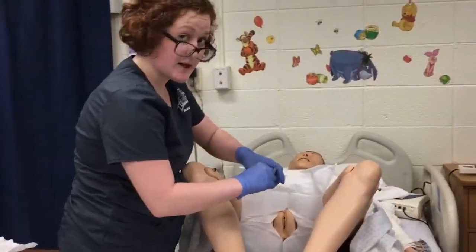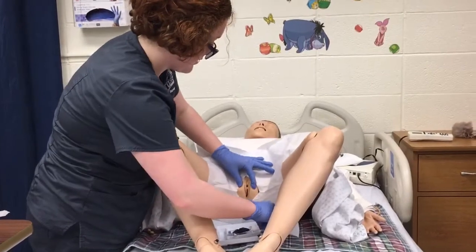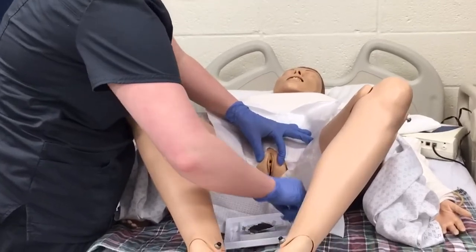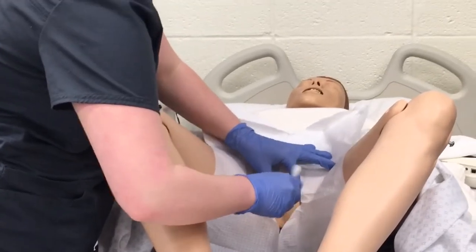I'm going to take my swab sticks out and separate the labia. I'm going to clean the farthest one first and discard, then the closest and discard, and then right down the middle.